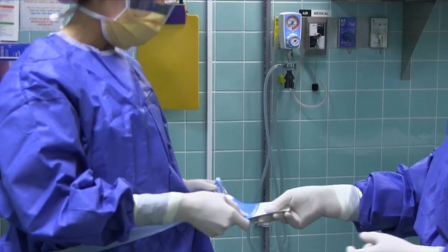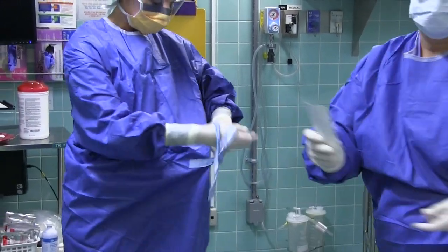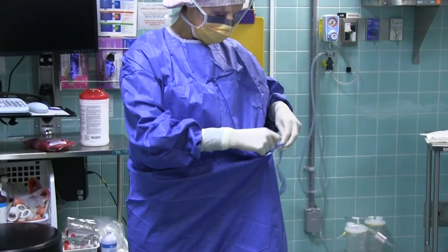Hand the string with the cardboard to the scrub nurse or any member of the sterile team, as well as a circulating nurse. Hold the other string in your left hand and turn counterclockwise. Tie the strings. Remember, the ends of the strings are not sterile.